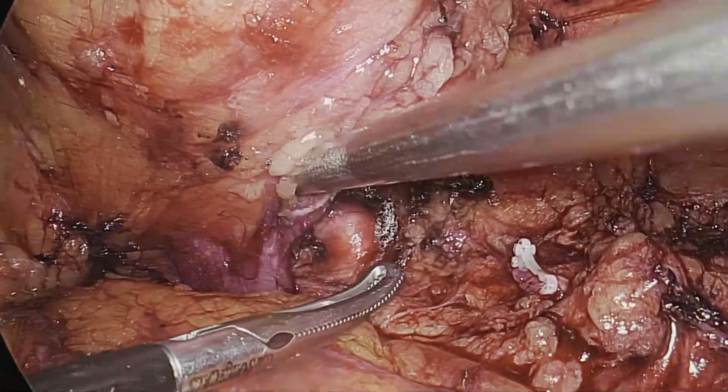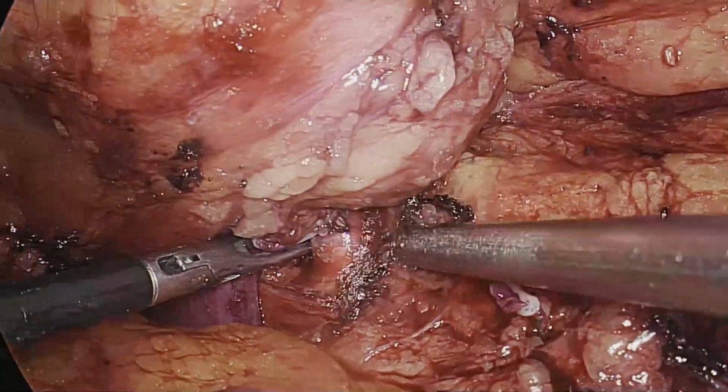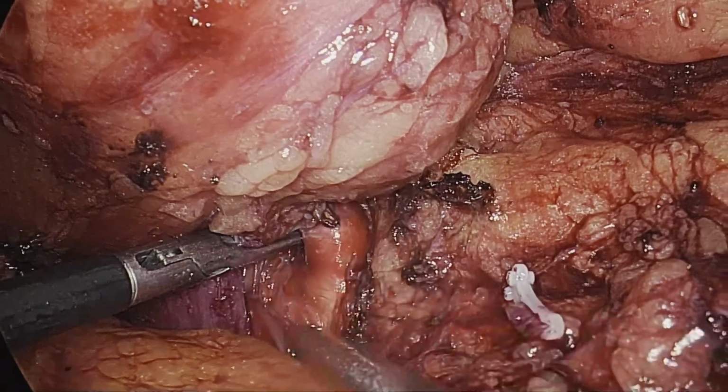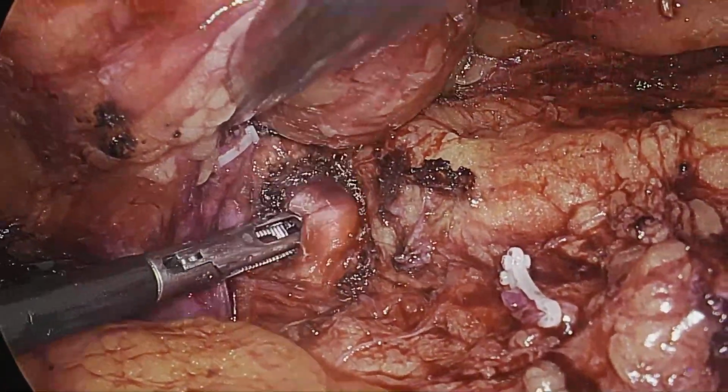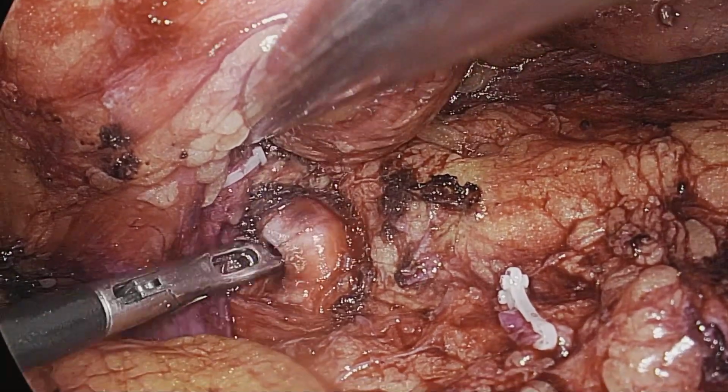So, during the dissection, what we can do is we can directly keep the lymphatics towards the specimen, and the rest of the para-aortic lymph nodes are dissected downwards.